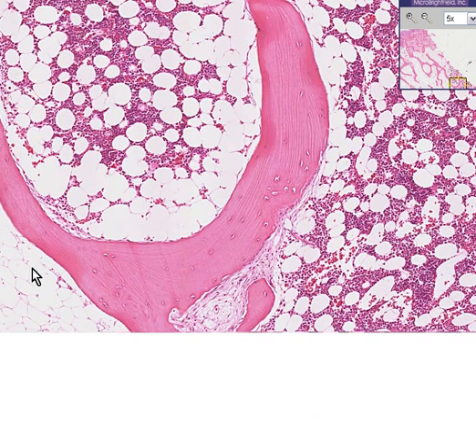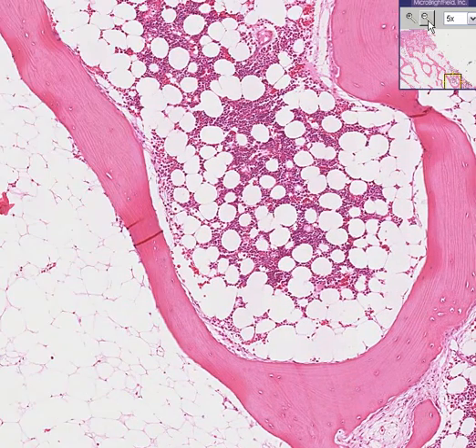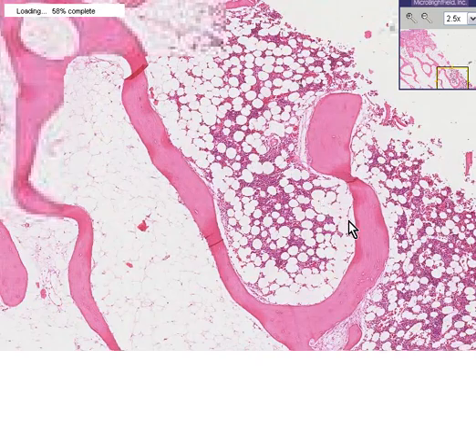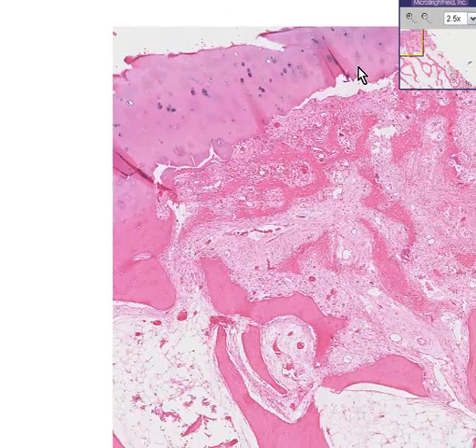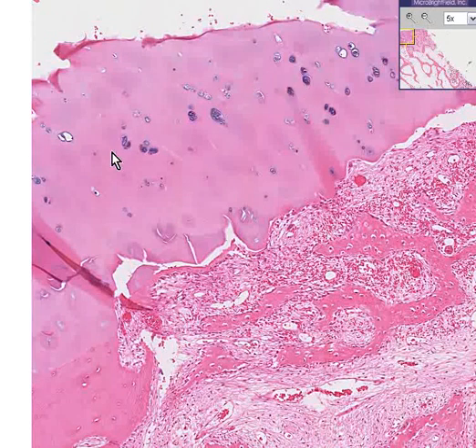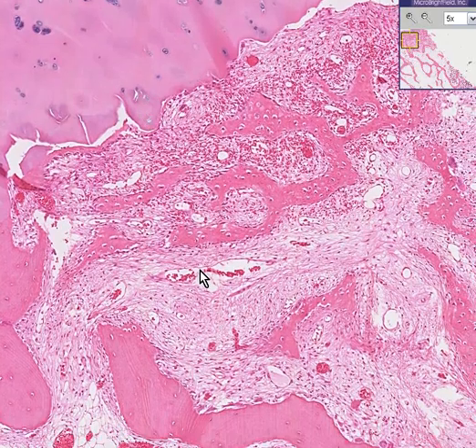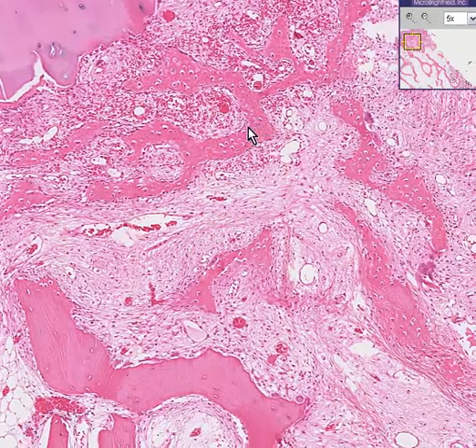So in this portion of bone, we not only had pure yellow fat or yellow marrow, but we also have red marrow or hematopoietic marrow because it is grossly red, and also the fact that it's making red blood cells as well. Let's go to the other end of this bone and take a look at the articular cartilage, just to show you that my original impression that this looks like mature cartilage is correct. And there's some activity there, osseous activity and some fibrous tissue between these spicules.